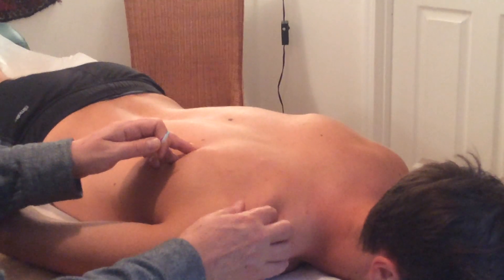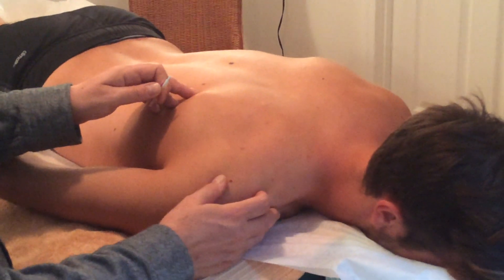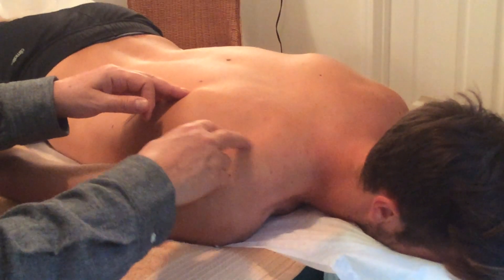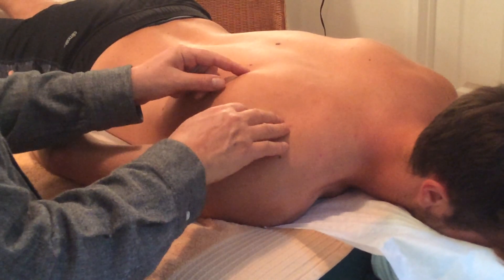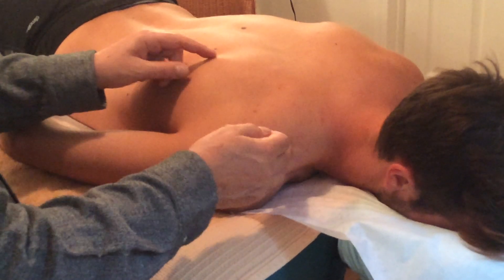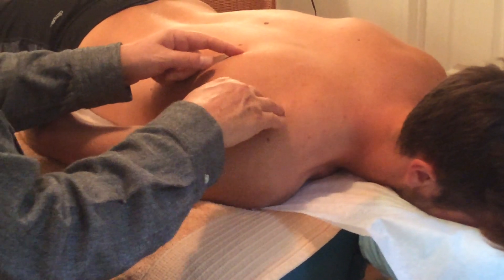I know because I checked him before the video that his supraspinatus muscle is actually quite good. If it weren't, I would needle the supraspinatus muscle just there. But the infraspinatus muscle — this is a classic Chinese acupuncture point. In fact, every point I've done so far has been a Chinese acupuncture point as well as a trigger point and motor point.